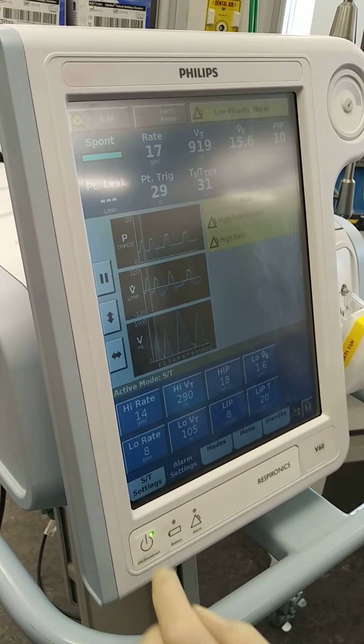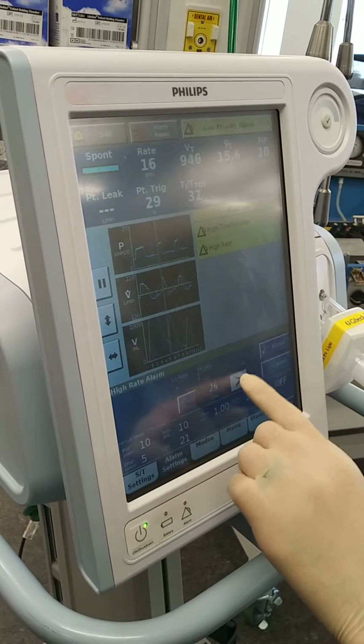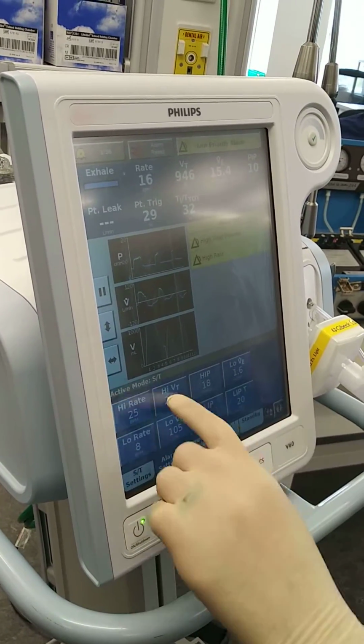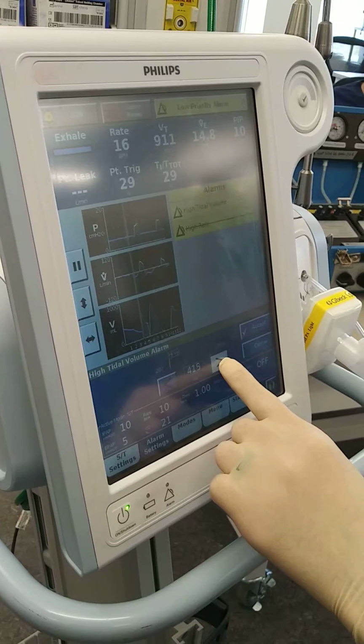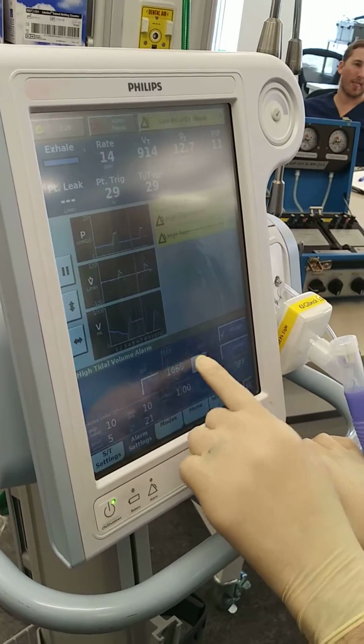So let me go into the alarms, and I'm going to turn my high rate up. She's doing 17, so I'm probably going to turn this up to like 25. My low rate of 8 is okay. Her tidal volume is 911, so I've got to turn it up above that. So probably go up to like 1200 or something, which seems high, but yeah, she's healthy.